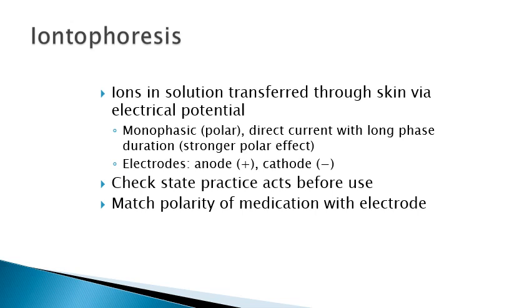You want to make sure that you match the polarity of the medication with the electrode, just like I said, because if you don't do that, the medication is not going to get driven into the skin. And you just want to monitor for skin irritations and burns. It does sometimes happen. Athletes will sometimes get small blisters or skin irritations. I just warn them about that ahead of time, just to give them a heads up. When it does happen, it's usually not a big deal. Some people, though, obviously can have more sensitive skin than others and react to the medication.